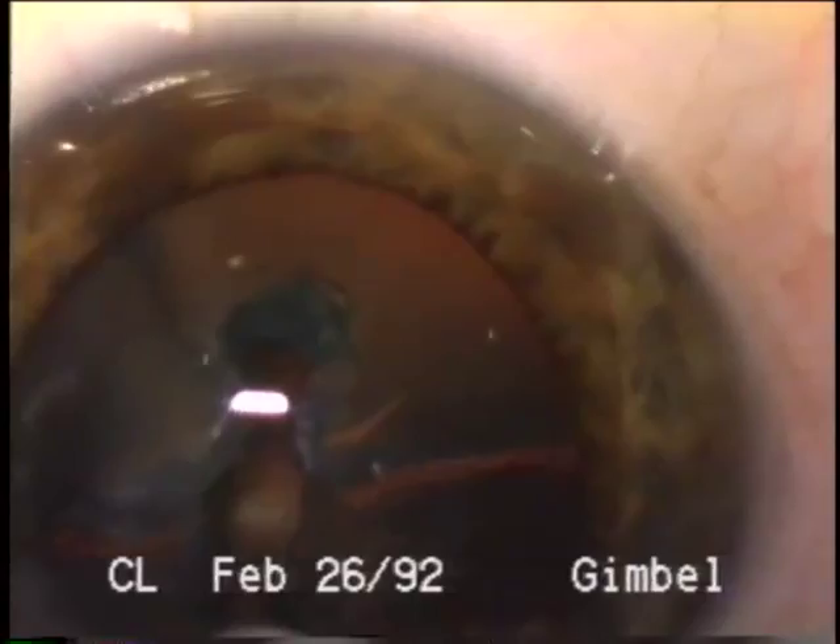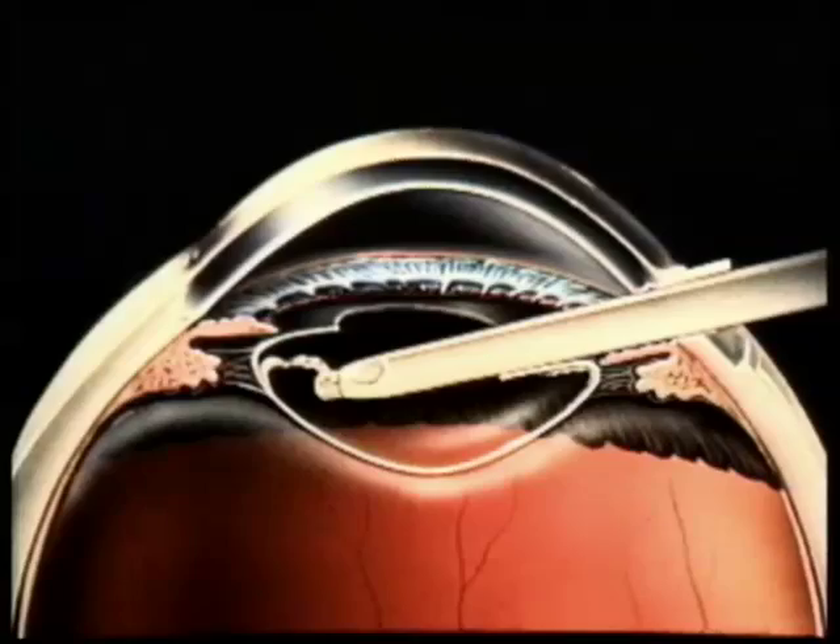Additionally, once the nucleus and epinucleus have been removed, the cortical material will fall away from the anterior capsule and may all be aspirated with the phaco port. If not, it is more easily engaged with the irrigation-aspiration port for stripping from the rest of the capsule. This is particularly advantageous for removal of the 12 o'clock cortical material, as demonstrated in this surgical footage. If this material cannot be engaged with the IA handpiece, I use a bent cannula through the side port to loosen it and then remove it with the IA.